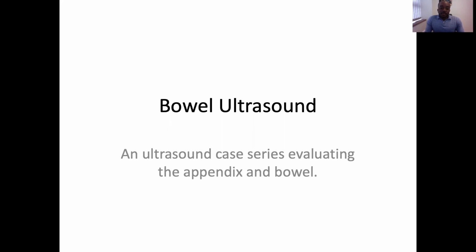We're going to be talking about bowel ultrasound, which would mostly entail an ultrasound case series evaluating the appendix and the bowel.